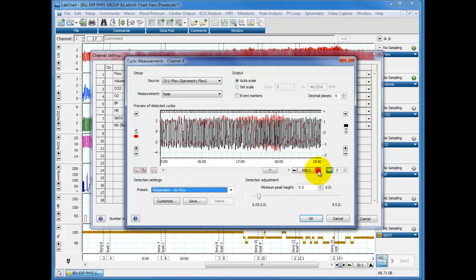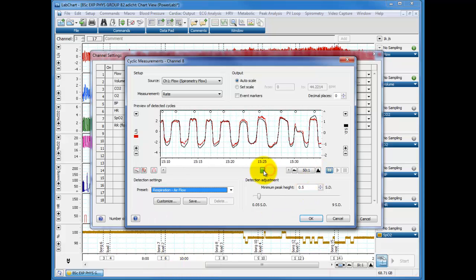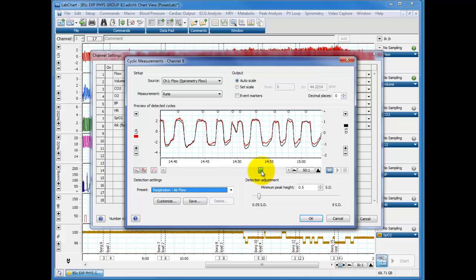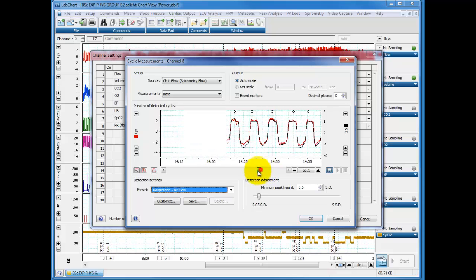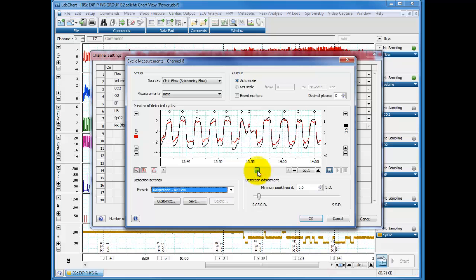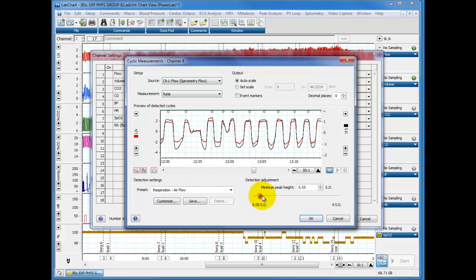And in the preset here we scroll down until we see respiratory air flow. And then just have a little zoom in and make sure that it's picking up all the peaks. It's picking up a double peak but that is a double breath so we'll leave that as it is. There's a double breath so just make sure that's working and that's all good.